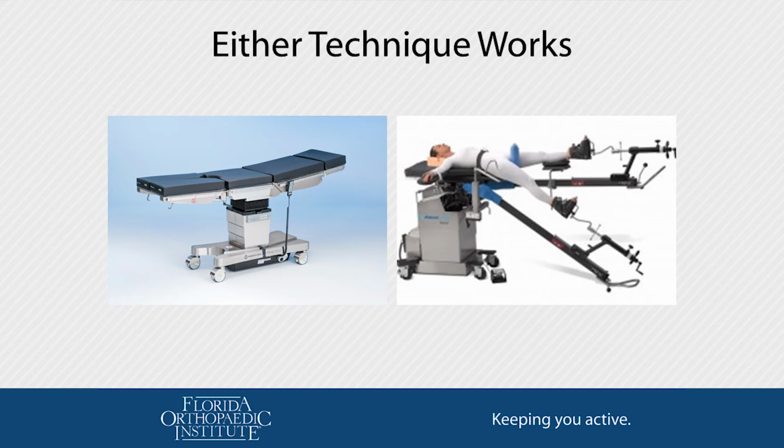So we can use the special table or the regular OR table. We prefer the special table. The patients, the therapists, and the nurses are all very happy without the hip precautions. Nowadays, actually, if I do a regular hip replacement, then Paul from therapy or Heather from therapy will call me up and give me crap of why I did it. And I actually have to explain to them why I did it. It's kind of like having an extra wife. So we try to do anterior approach if we can.